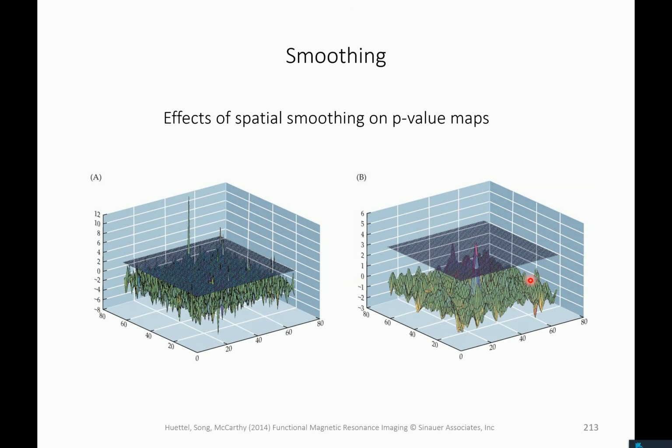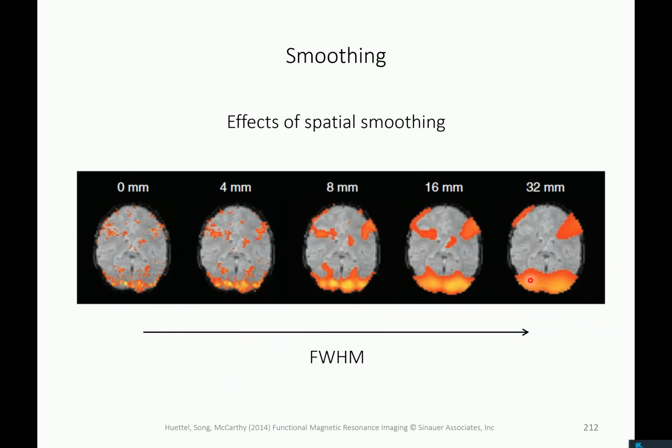We discussed, I think, at one point also this matched filter theorem. One reason why one wants to do smoothing is if one assumes that the activations in the brain actually look a little bit like what you see here, these kind of sub-blobs. Of course this is not the right representation, you see that better here. That's one way you can justify smoothing. You can also say, well, this looks a little bit salt and pepper style. Nobody will believe me that here really something activated. Let's smooth it. Ah, yeah, now it looks nice.